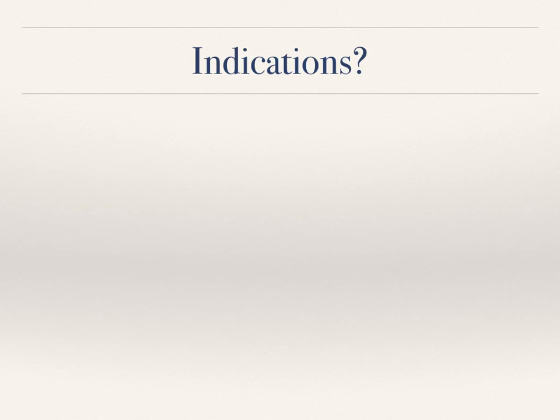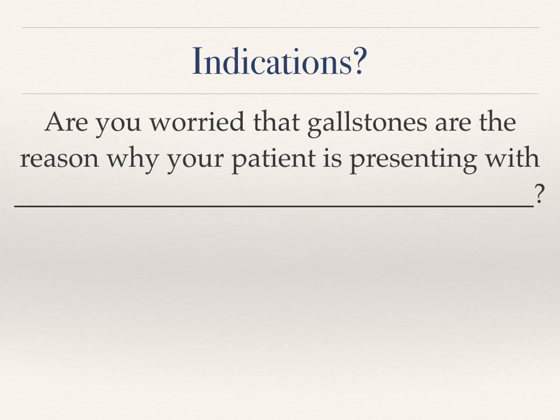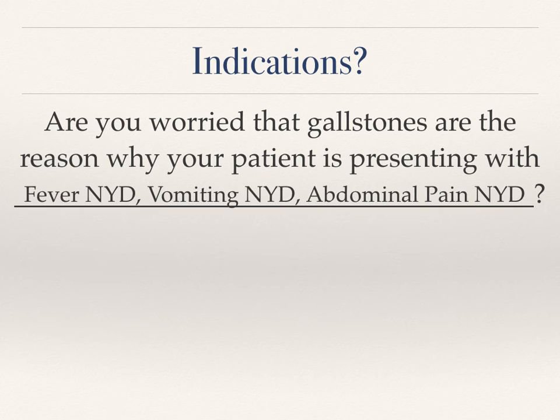Sometimes when we go about scanning patients, for whatever reason, we can be too general and not think of it in a proper clinical context. If that's the case, we might have a question like this: are you worried that gallstones are the reason why your patient is presenting with, and then you fill in the blank. Again, there's no clinical correlation here. The three indications that we tend to think of are fever NYD, vomiting NYD, and abdominal pain NYD.